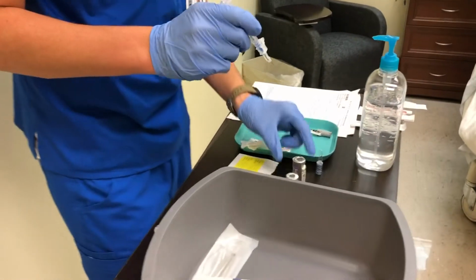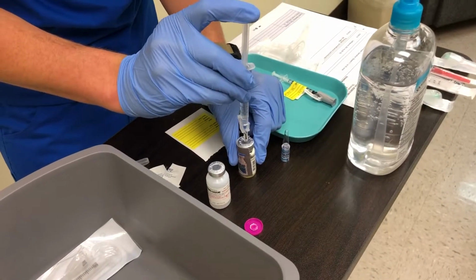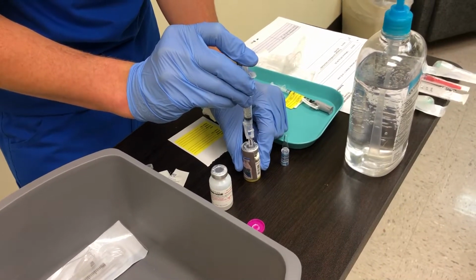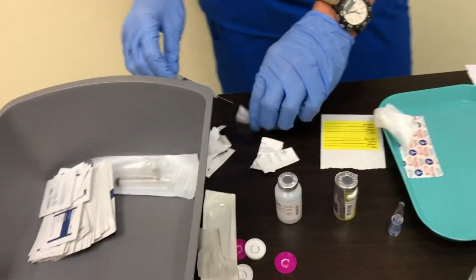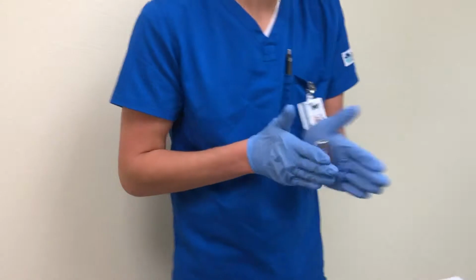And then I can put it into the medication. Okay. Then I can do the safety sweep. And discard the sterile water and then mix.